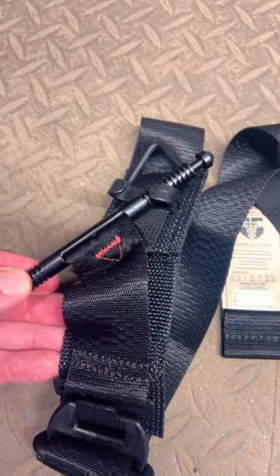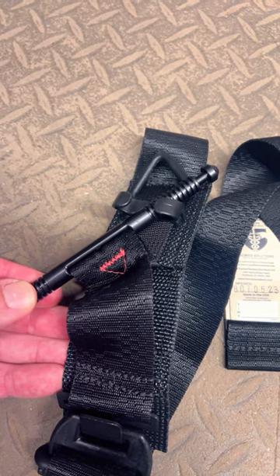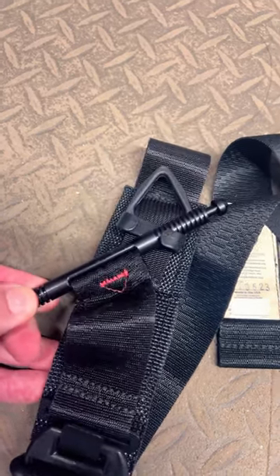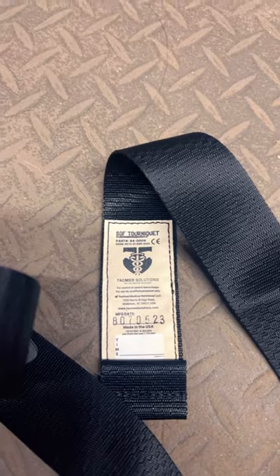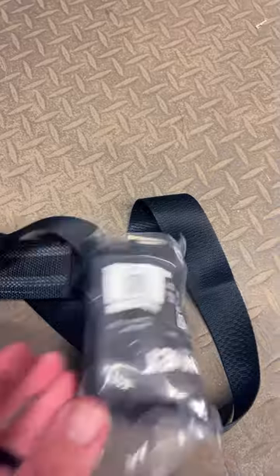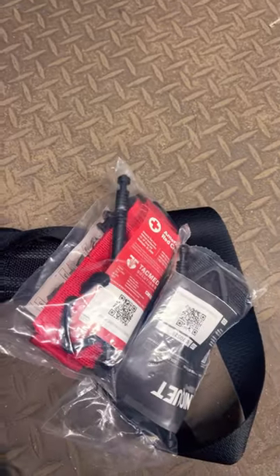It has this indicator here which is going to let you know the tourniquet is tight enough — it'll actually disappear when the tourniquet is tight enough on the arm. And then there's your time stamp. The soft tourniquet comes in black, red, orange, or blue trainer.